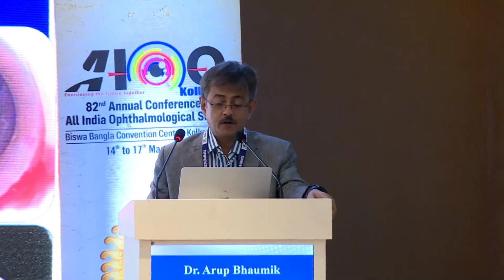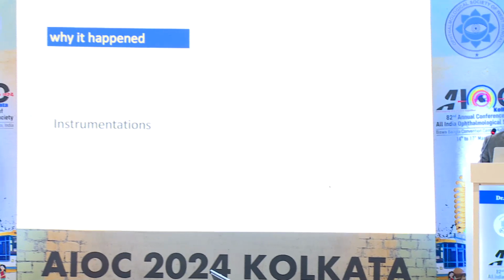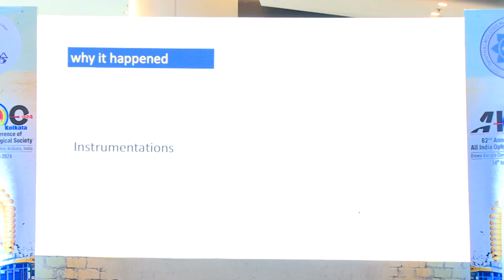Thank you so much for giving me another topic, Descemet detachment, noted in the table, or post-operatively what to do. Why does it happen? It happens during any instrumentation, except in a few cases it can happen spontaneously, like PPMD. Otherwise, this can happen spontaneously. You can see the patient is absolutely fine. Next 2 days, there is a total Descemet detachment.